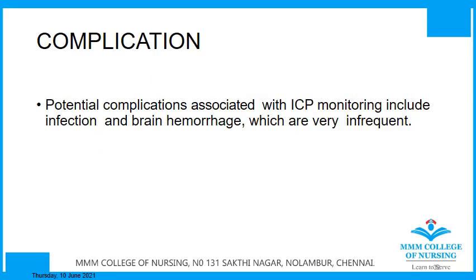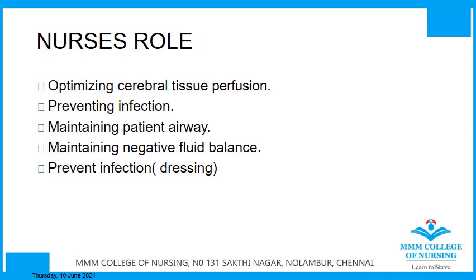Let's see what is the complication. Potential complications which are associated with ICP monitoring are infection and brain hemorrhage. This is very, very infrequent. Moving on to the nurse's role. So as a nurse, you must be aware about optimizing the cerebral tissue perfusion, preventing infection, maintaining patent airway, maintaining negative fluid balance, and preventing infection in the dressing site or in the insertion site.